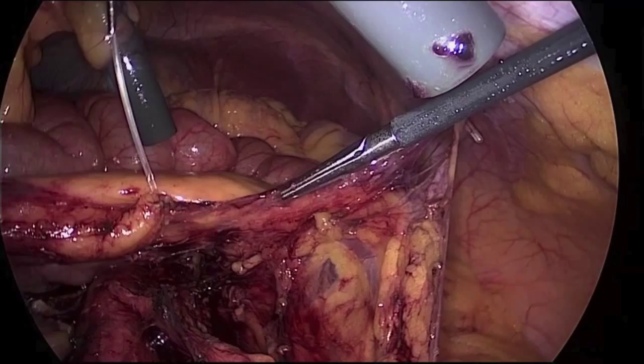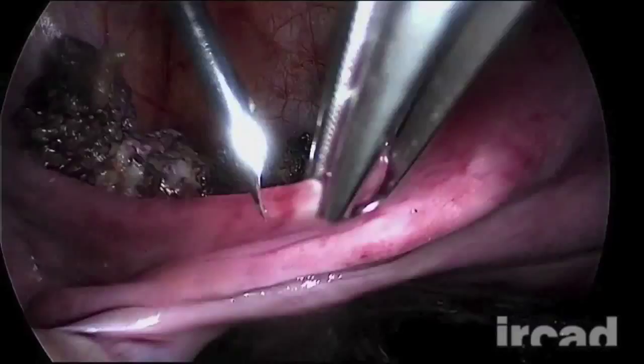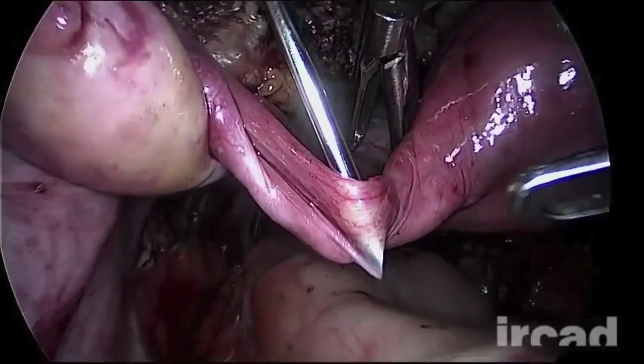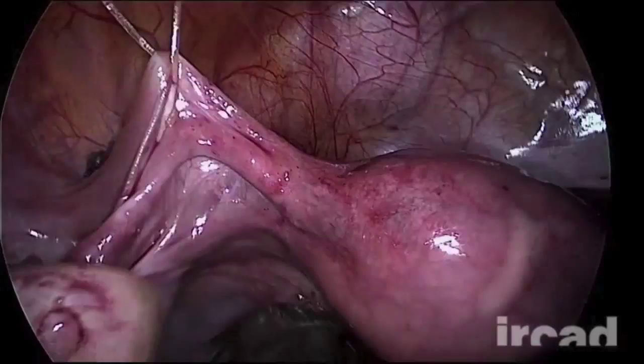The uterus can be suspended by the round ligaments using the T-Lift device. Attention should be paid to avoid damaging the epigastric arteries in the abdominal wall, and the operator should be aware of the position of the fallopian tubes. This technique is particularly useful when the uterine manipulator cannot be used or must be removed, for instance when a bowel resection is performed through natural orifices. The wide exposure of the posterior compartment is demonstrated.